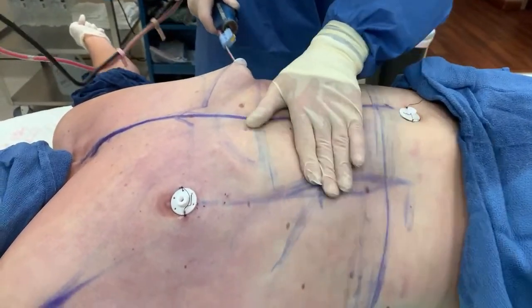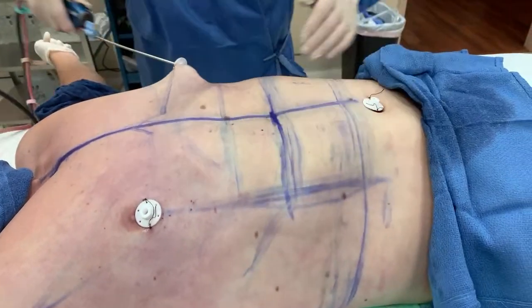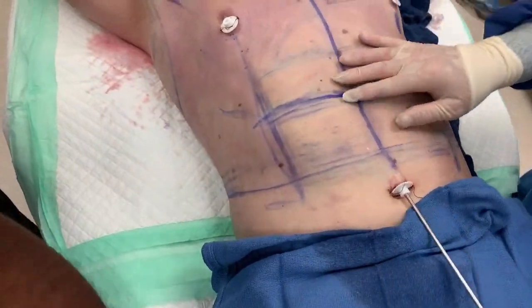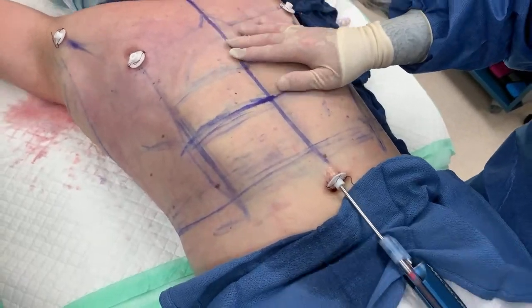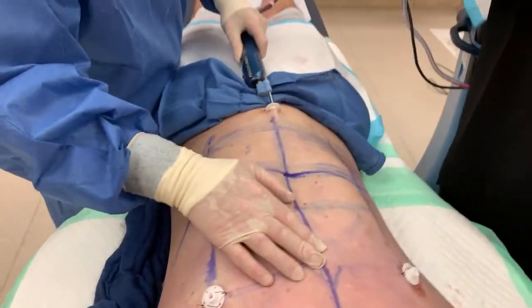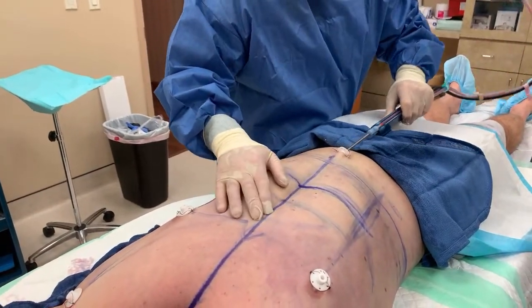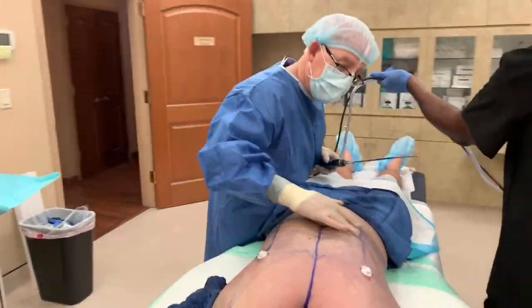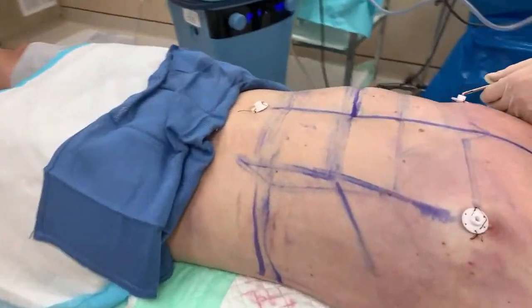So we're starting to really, really dynamically see what I want to see. Get around it — go nice and slow, and stretch up the width. There we go — look at that. See? Good. And I haven't started this side yet — see the difference? Beautiful.